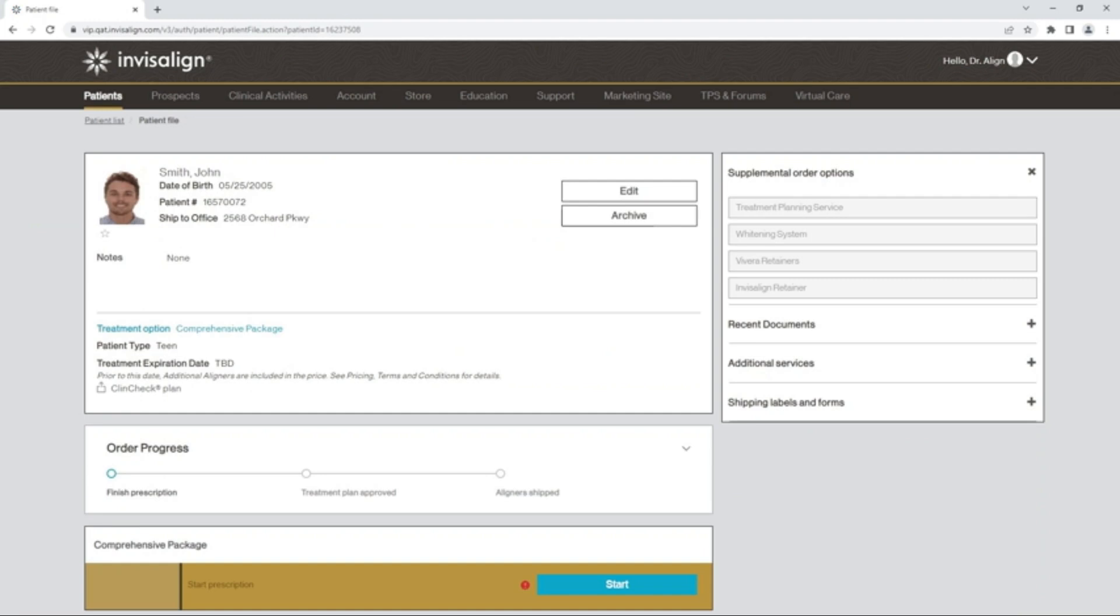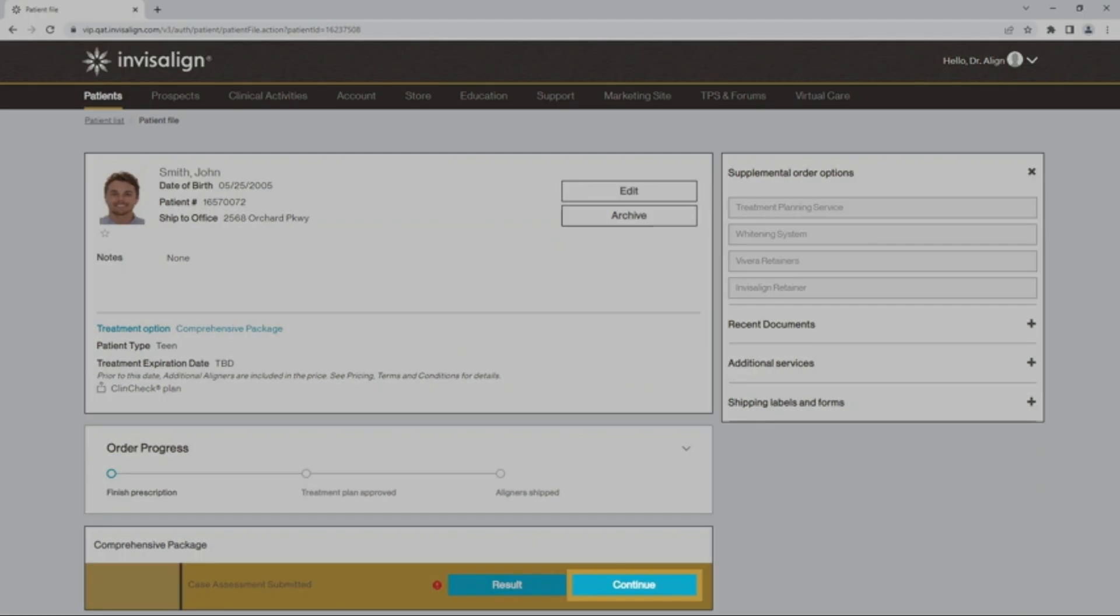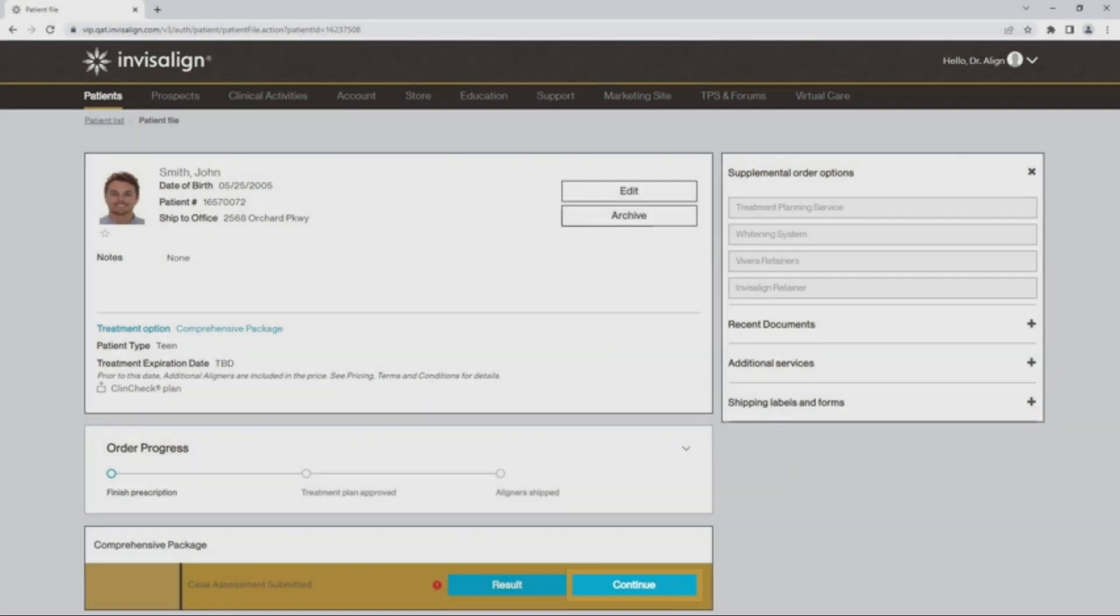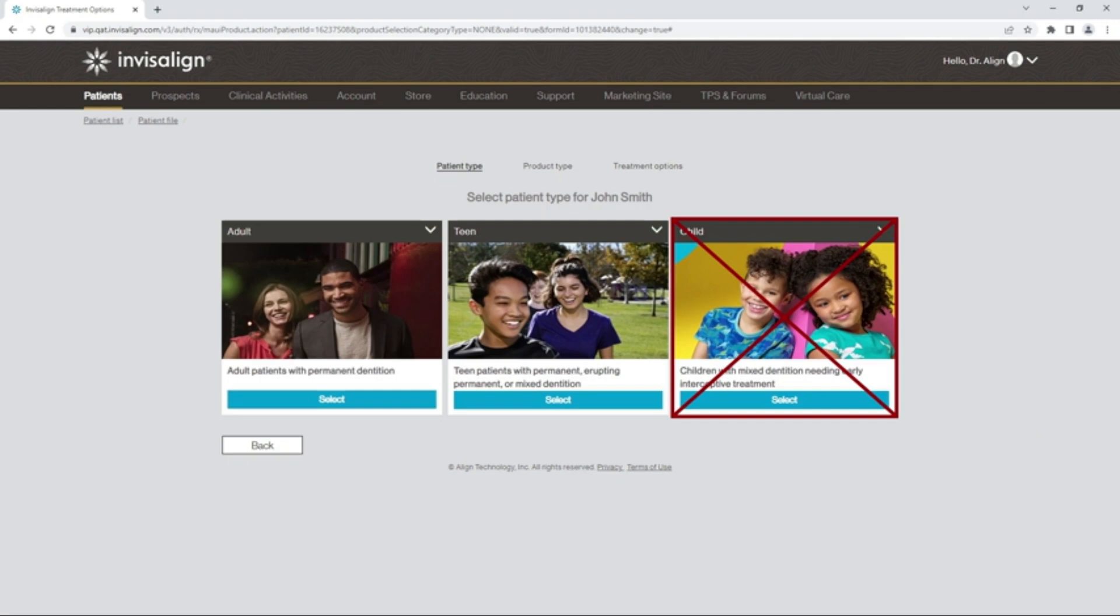The prescription start is the same that you have been using. Once you have created the patient and loaded the intraoral scan images, you can simply click Continue to start the prescription submission process.